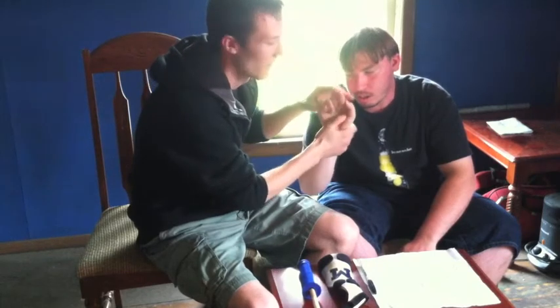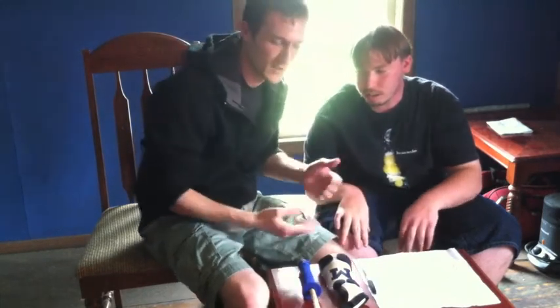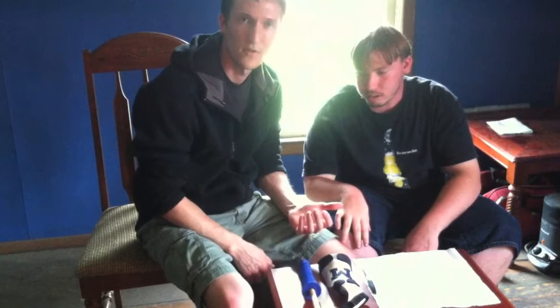and then also to help extend the fingers. So the first thing that we want to do when we're designing a splint is try and look at the functional purpose of it.